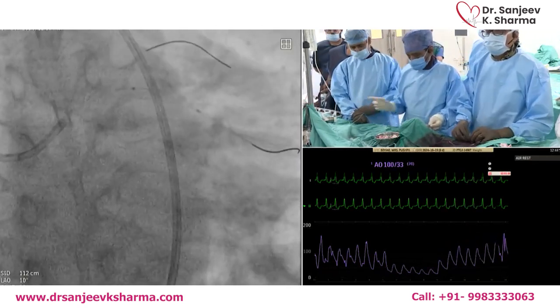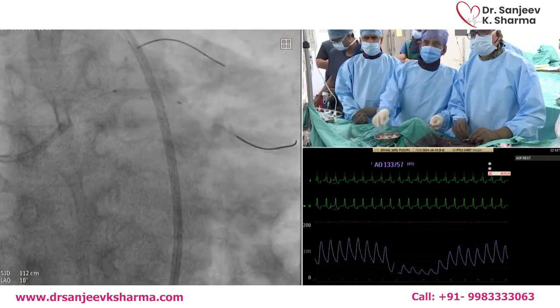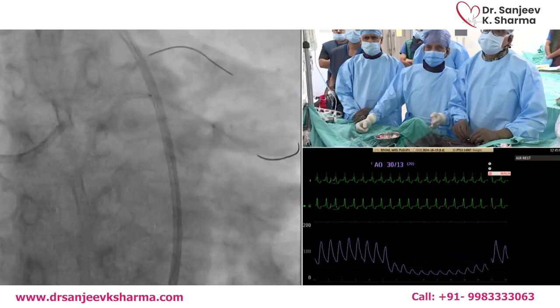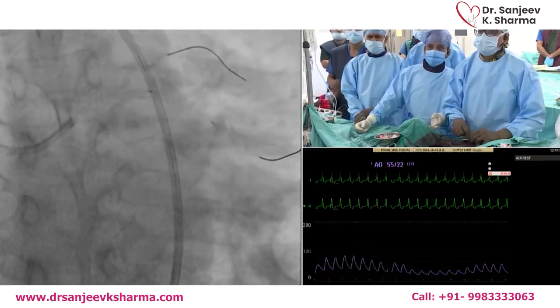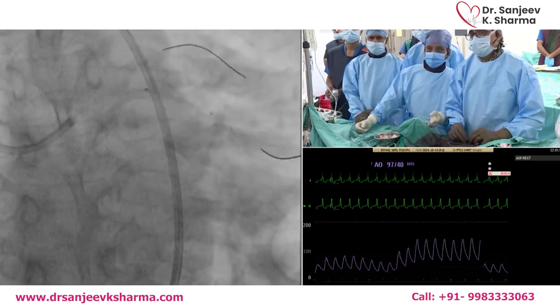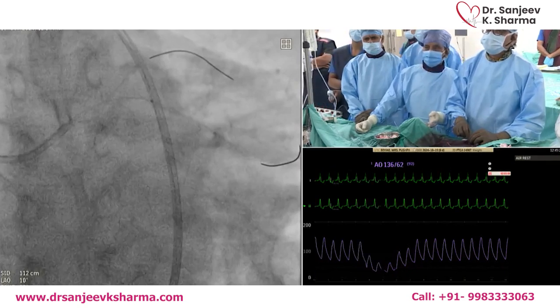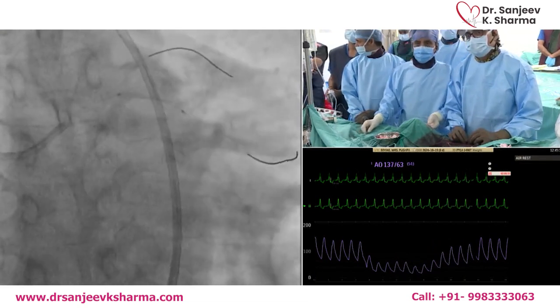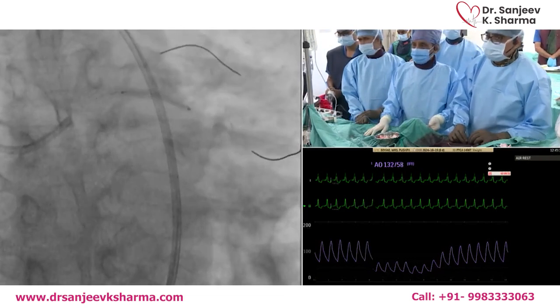No, that is true. So it has been said that for the large vessel, if you can go to 120,000 RPM, and it's not a very tortuous vessel, going to 120,000 RPM will give you a 1.8 millimeter lumen maximum. So the question is, do you need to? To me, both devices are very effective. Particularly, orbital is actually more effective than rotational atherectomy because of deep cuts. In our original 40 patient study, we showed on the OCT clearly that orbital causes more deep cuts, but at the same time causes a little more perforation. And that has been our experience also, 16, 18, 20. It definitely caused a little more trouble.